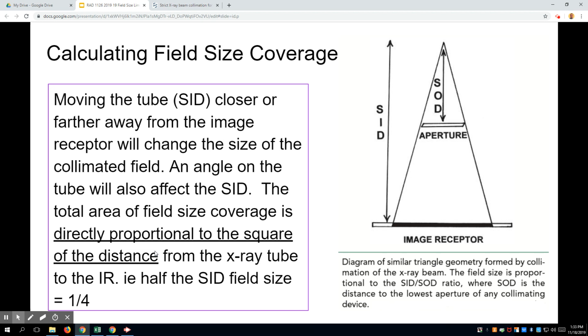So how does one get around this fear? I think it takes practice. I think you need to analyze each image that you take and ask yourself after each one, could I have collimated more? Just a little. I mean, we're talking about a centimeter, technically. We would love more, but I want evidence. Evidence is it's there or it's not. So if there's a quarter of an inch, then it's there. The more sides, the better, of course.